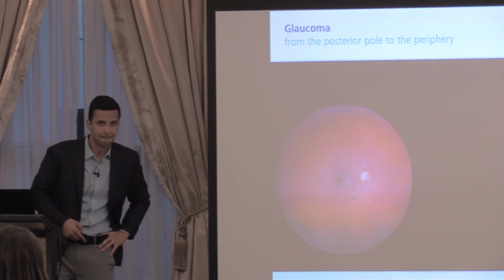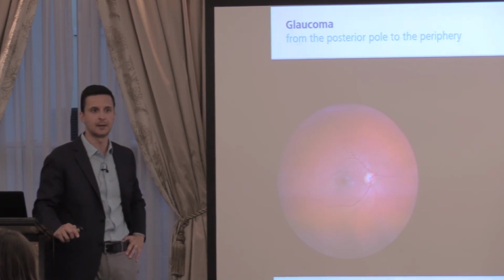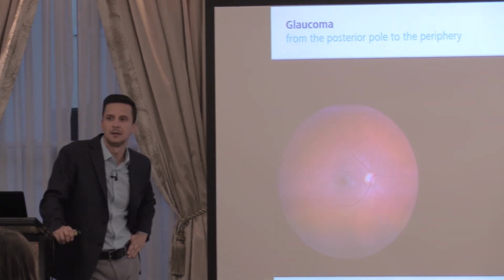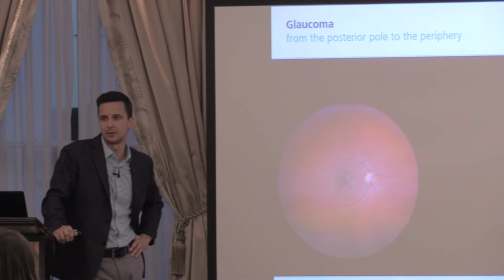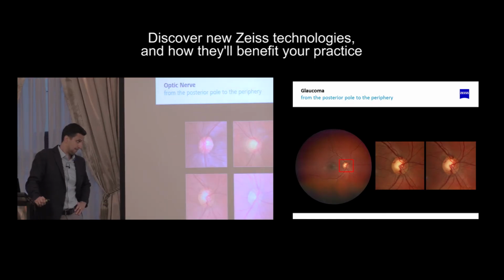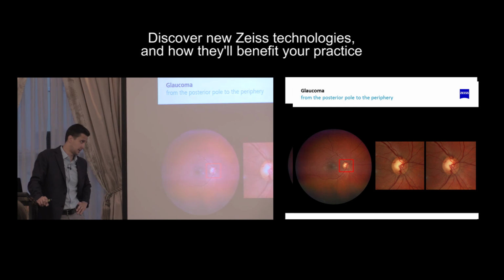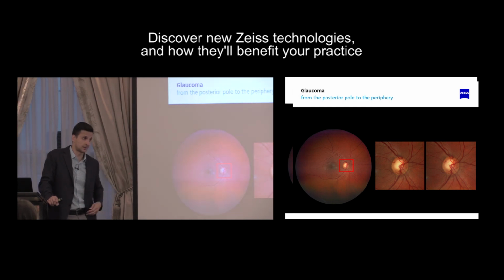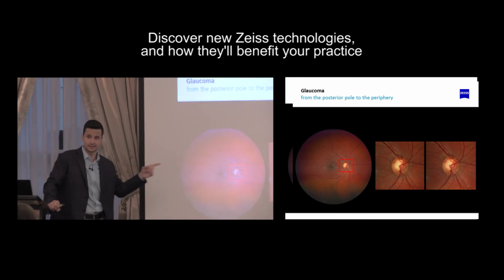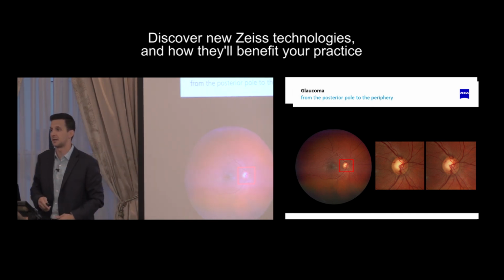So glaucoma. What if we were to use this in glaucoma? Now I showed you a blue filter in it, but you need to still be able to take what in glaucoma? What kind of photos of the optic disc? Stereo pairs, right? So here's your stereo pairs coming out of that. And you'll have to take my word for this because I did it on the airplane and almost made myself sick: if you cross your eyes just a little bit and take a look at those, you can make depth pop out of these 2 images in terms of the way in which they've been snapped. So there's a stereo pair function on here as well.